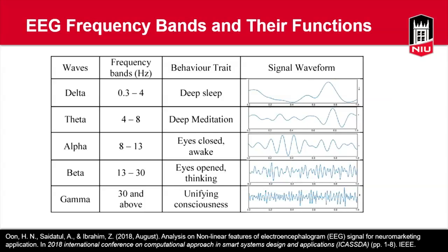You can see our signals are very, very busy, with a lot of frequency, which means you tend to have more concentration. So we divide the initial electrical signal into 5 different frequency bands and see how much portion autistic children are in. Is it the deep sleep zone, the normal zone, or high concentration? So that's how we evaluate.